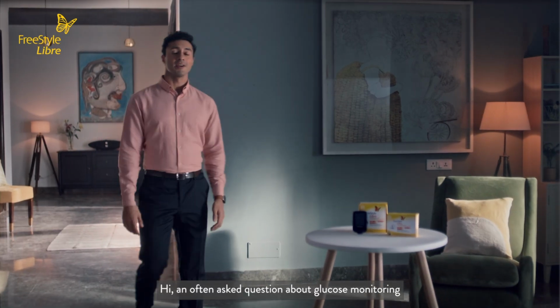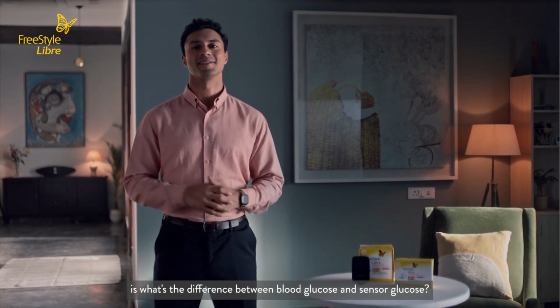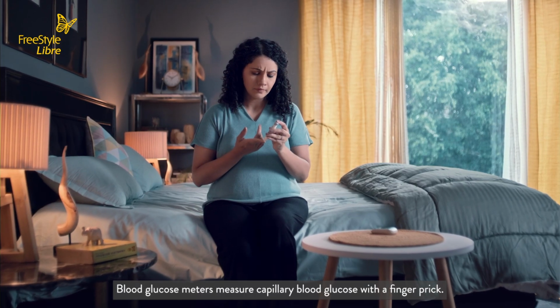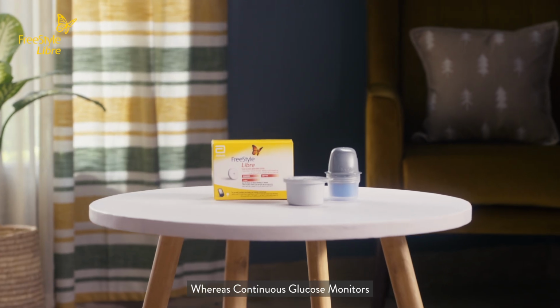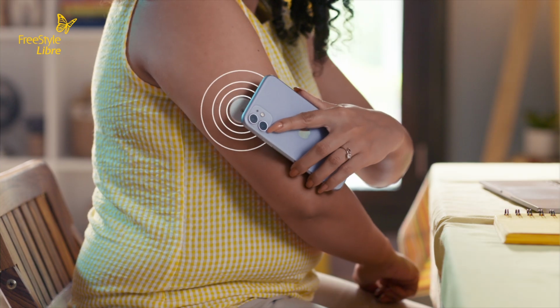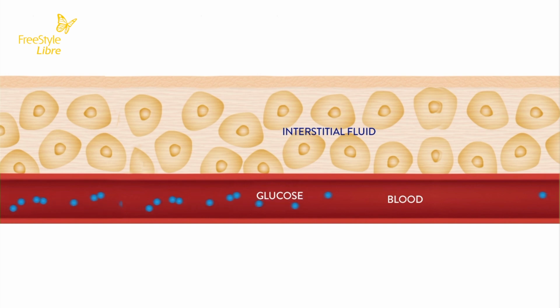Hi. An often asked question about glucose monitoring is what's the difference between blood glucose and sensor glucose? Let me try and explain. Blood glucose meters measure capillary blood glucose with a finger prick, whereas continuous glucose monitors like FreeStyle Libre measure glucose levels from the interstitial fluid, which is a thin layer of fluid that surrounds the cells of the tissues below your skin, not from your blood.